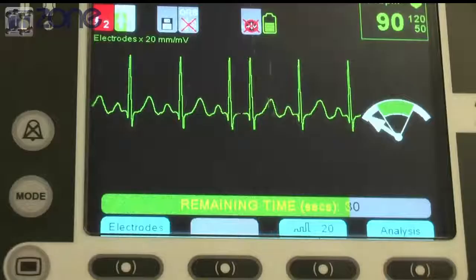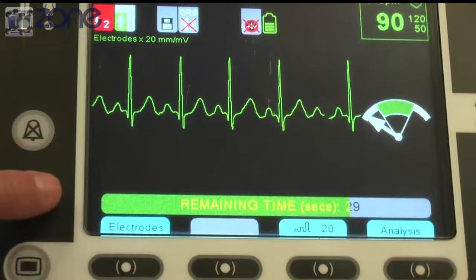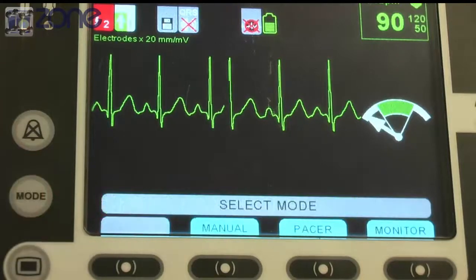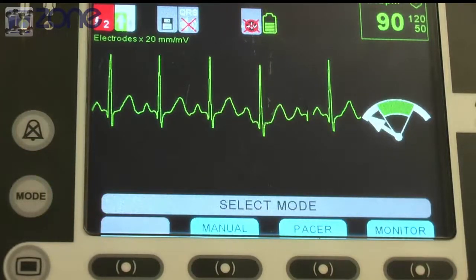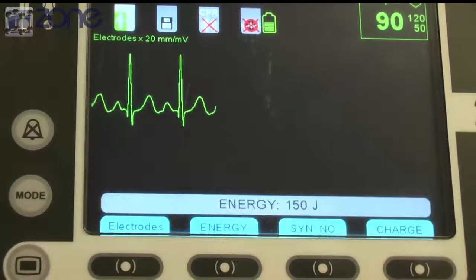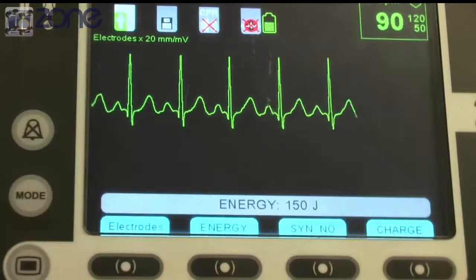So this shock test was in automatic mode. To change to different modes, you can press the mode button. This will allow you to enter manual mode, pacer mode, or just to monitor patients. You can enter manual mode which will allow you to change the energy as you wish, or charge or disarm the shock.